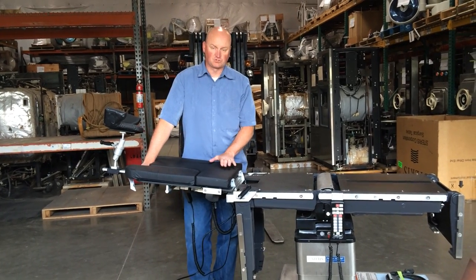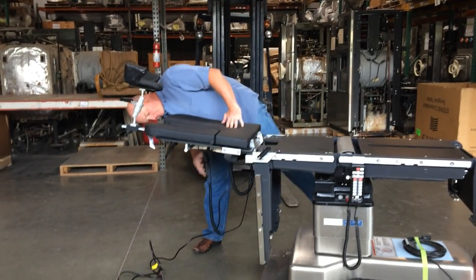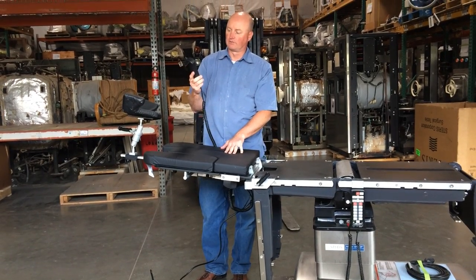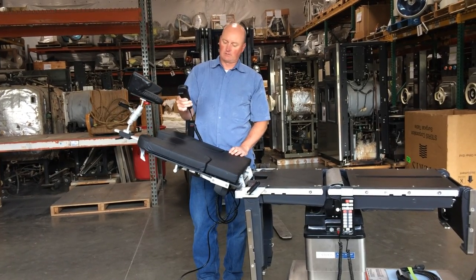Hi Lori, so this is the SureMed beach chair that we were talking about. This is the powered unit, so we're going to have full control with the power and control here — just up and down basically. You see it's coming up and then down.